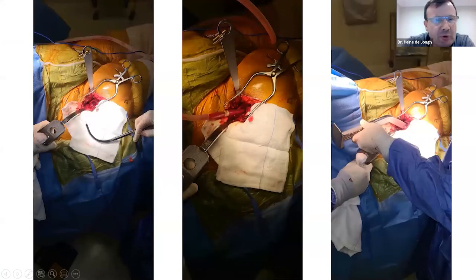So femoral preparation, I want to be quick here. So I use some curved reamers just to find the canal. One of your safety tricks, I suppose, again, is that before you go further, you must find the canal. You can't hope that you're there. The suction tube is always a nice way of finding the canal as well.